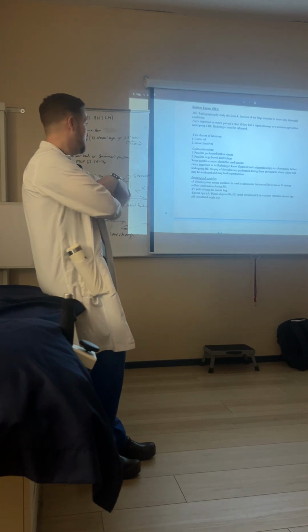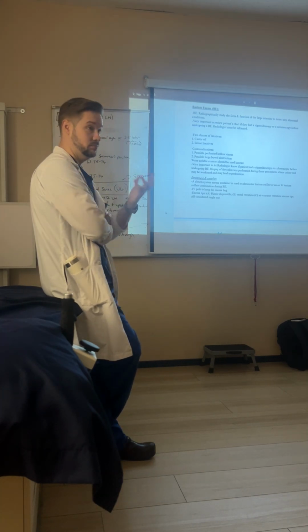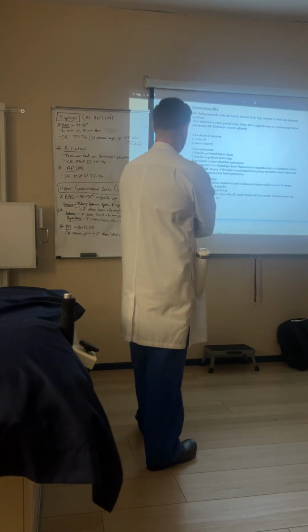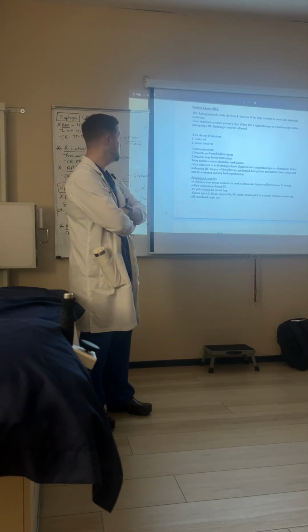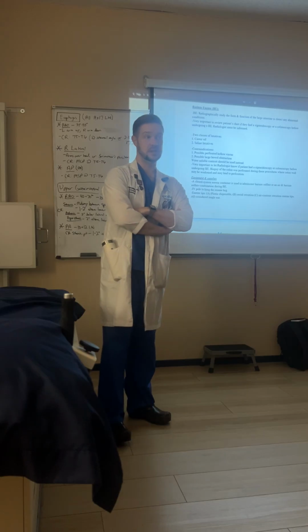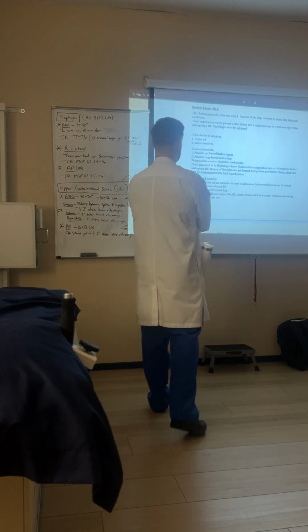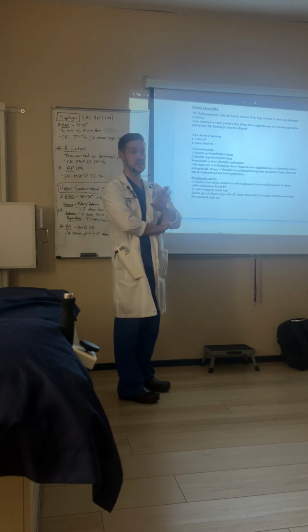In a pediatric environment, we're looking for some kind of congenital abnormality with their large intestine. If it's an adult, it's probably going to be to evaluate for some kind of cancer. It's very important to review the patient's chart if they had some kind of scope procedure recently, sigmoidoscopy or colonoscopy, because we don't want to give barium to somebody who may have a perforation, and the colonoscopy could have caused a perforation, theoretically. So if they have had a sigmoidoscopy or colonoscopy, we're going to let the radiologist know before we even get started or set up with anything.